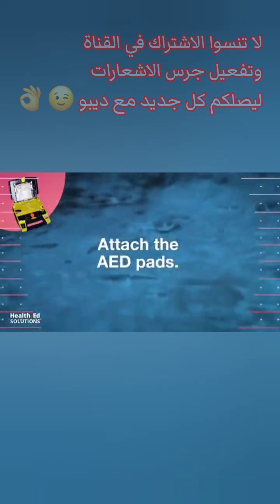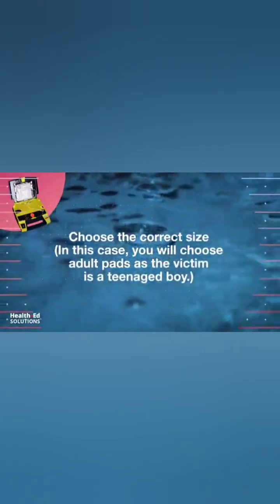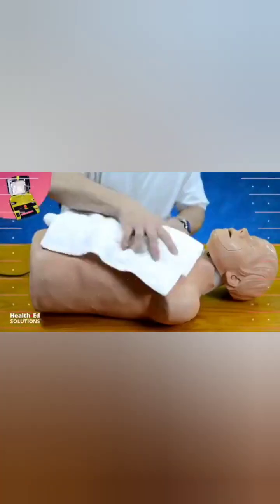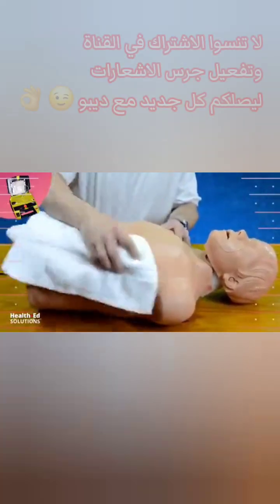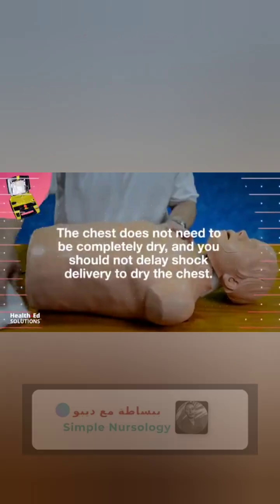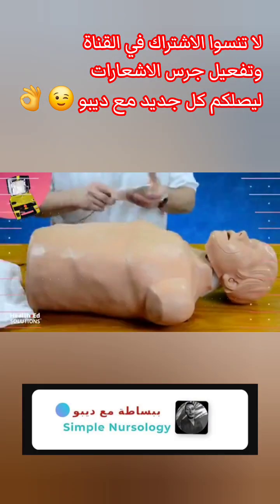Attach the AED pads. Choose the correct size. In this case, you will choose adult pads, as the victim is a teenaged boy. Quickly dry the chest if it is wet. The patient in this scenario is a drowning victim, so the chest would likely be damp or wet. However, the chest does not need to be completely dry, and you should not delay shock delivery to dry the chest. You quickly wipe the patient's chest with a towel.